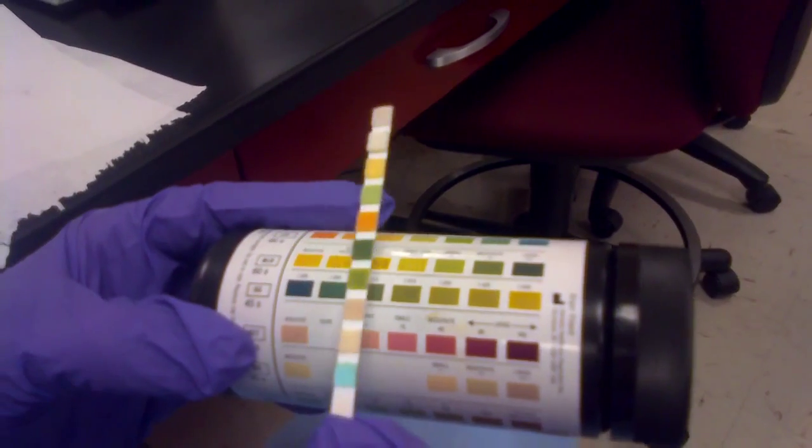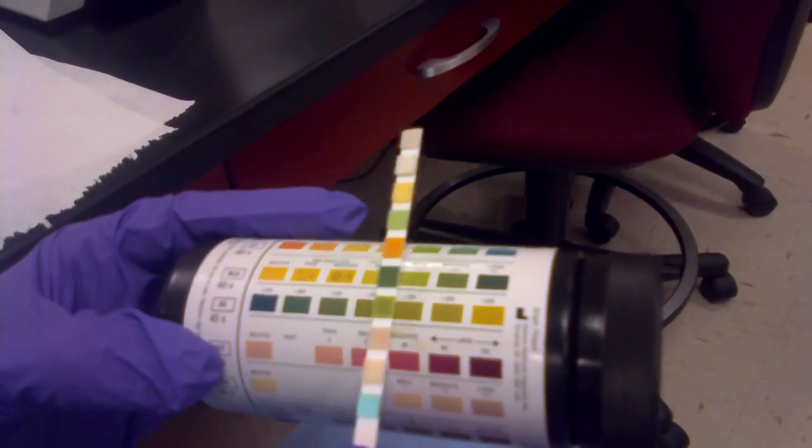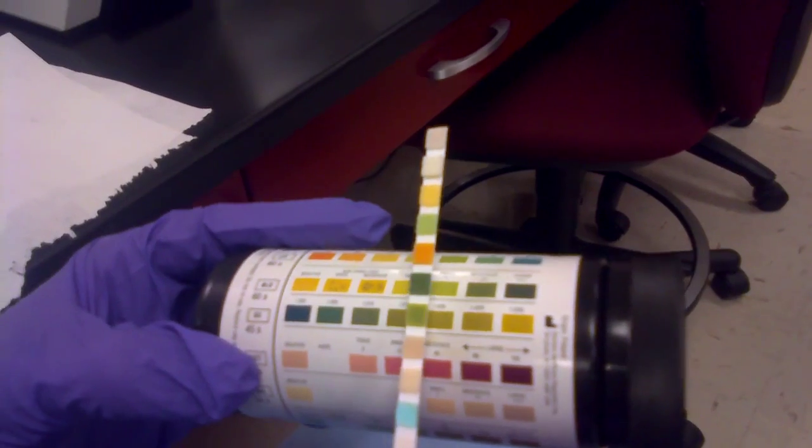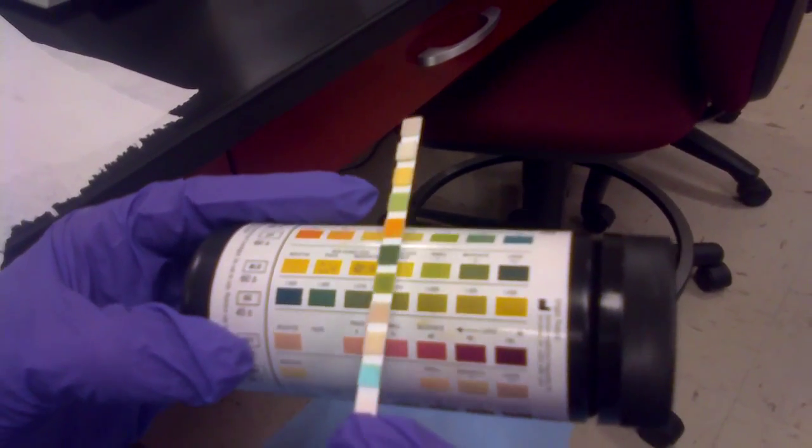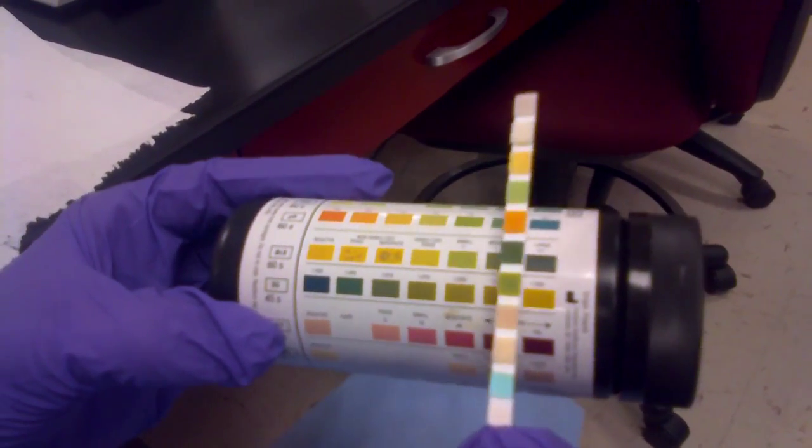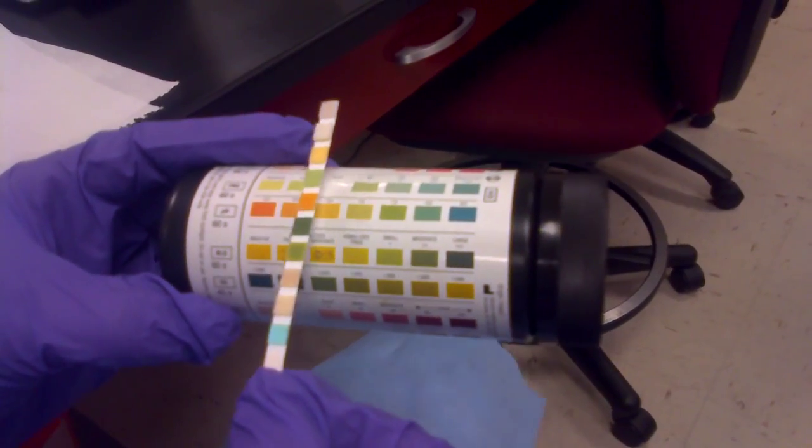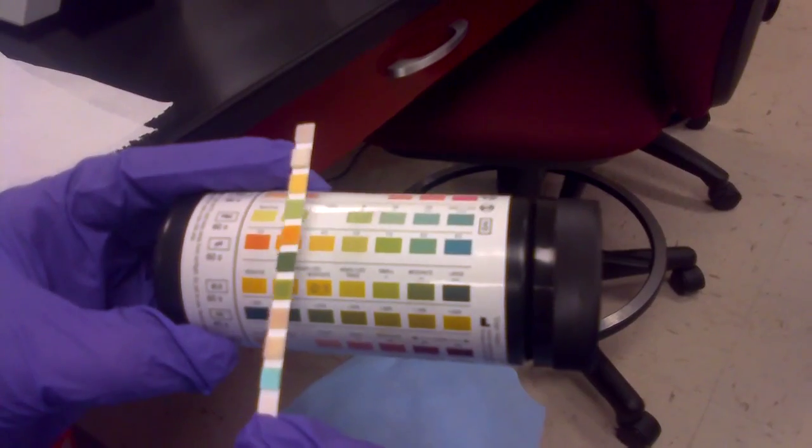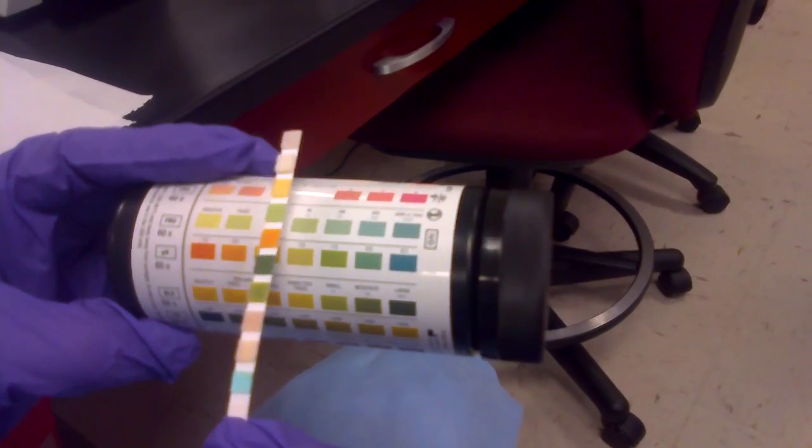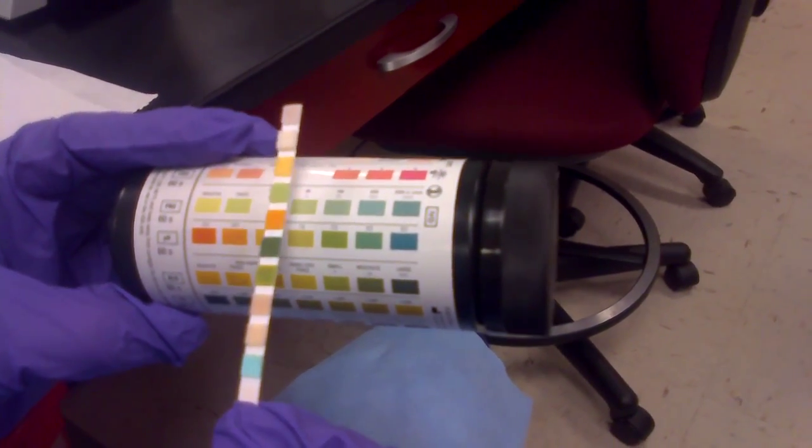Specific gravity is next. We have a specific gravity of 1.015. Next is blood. We have a large amount of blood. pH is next. We have a pH of 6.0. Proteins are next. We have a positive for protein.